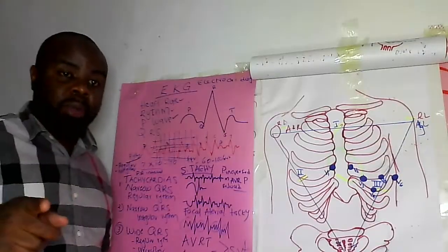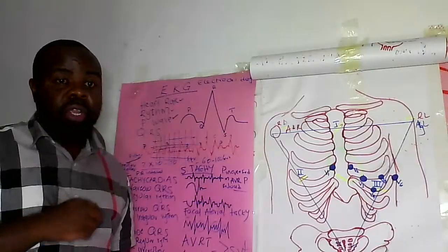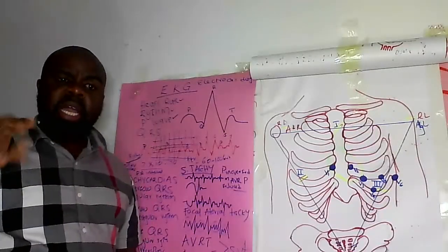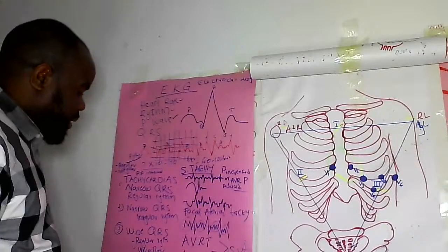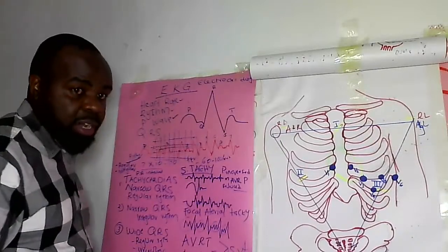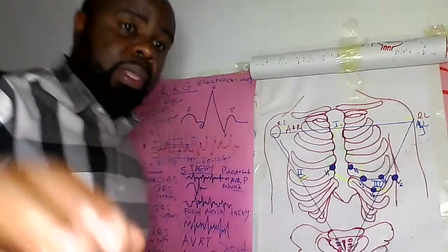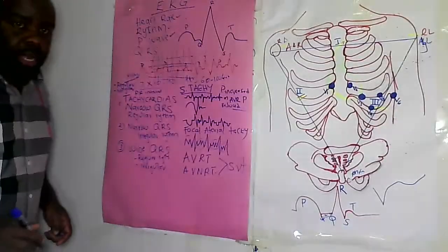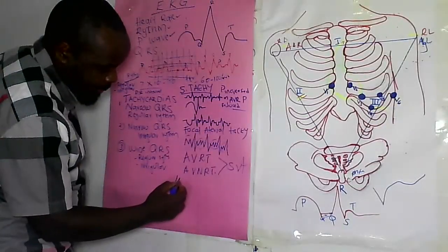But there is something where your focal point and the sinoatrial node is making a lot of beats very fast, and then you have a beat that is going so fast that even the machine itself cannot specify. So you get something like this.